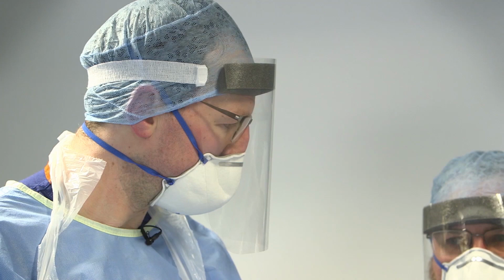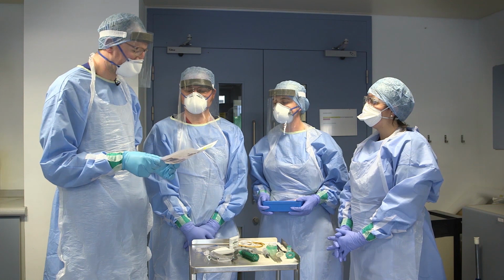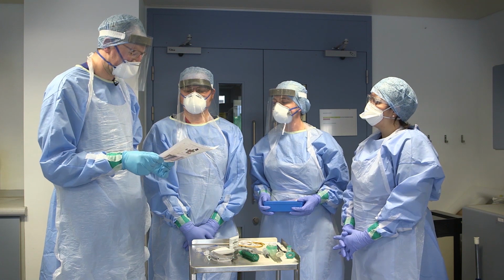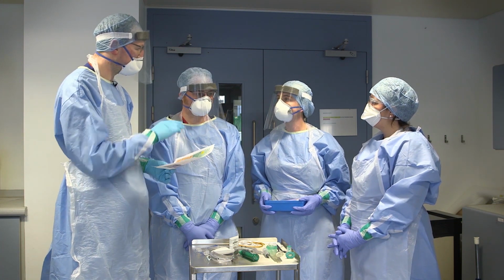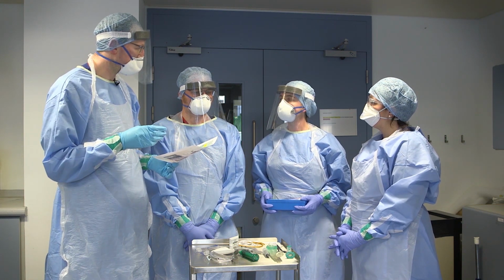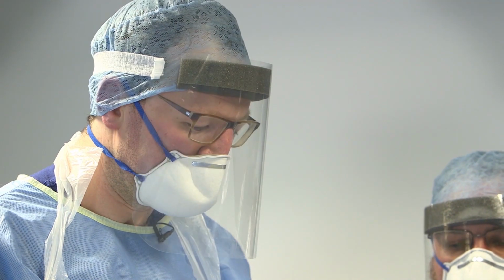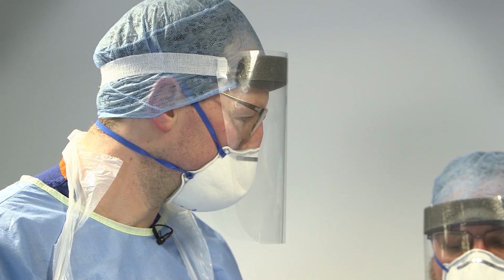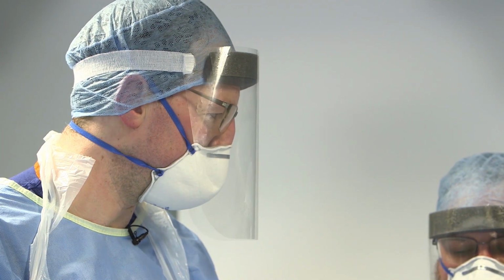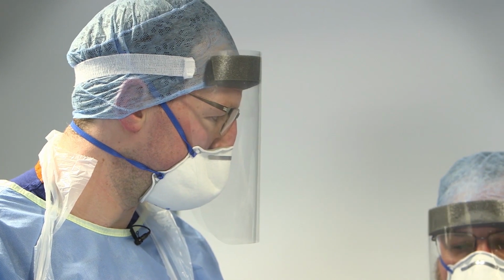So I will maintain the airway, and if you're happy to ventilate. Yep. If we fail at that, I'll declare a can't intubate, can't oxygenate situation, and we'll move on to plan D, which is front of neck access. At that time, if you're happy, we can swap roles. So you will come around and hold the airway, and I will be performing the front of neck access. Yep. Following successful intubation, we need to ensure that we have a secure airway before ventilating. So Trevor, I want you to inflate the cuff while I attach the water circuit, and I'm not going to ventilate the patient until I'm happy that the cuff is inflated.